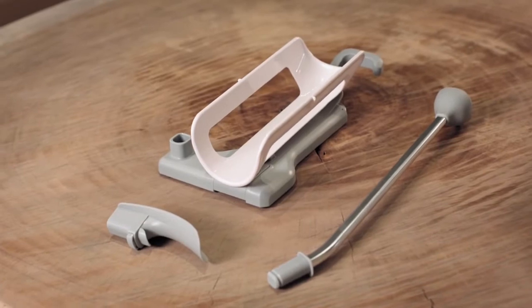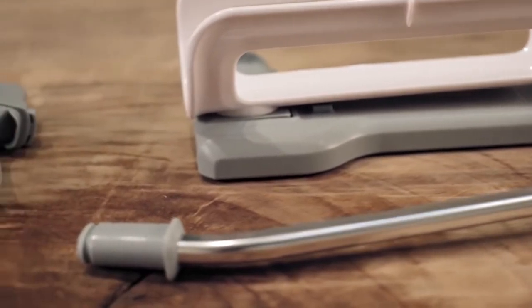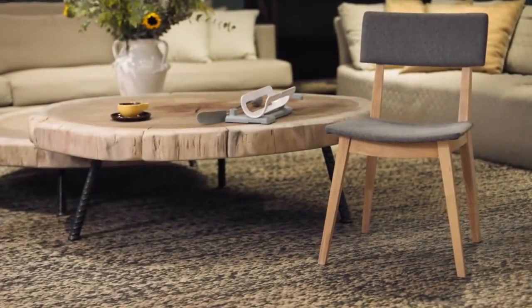Congratulations! You're the proud owner of a new Socky device. You've taken the first step to independently perform the daily task of putting on your socks. Now, let's take a look at how to get the best out of your new Socky.